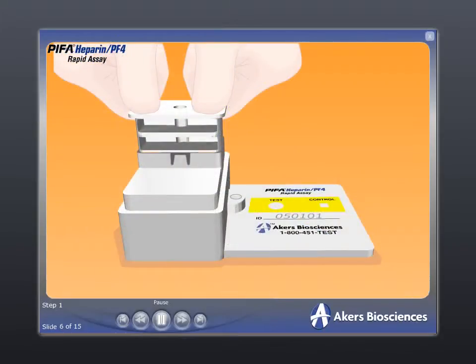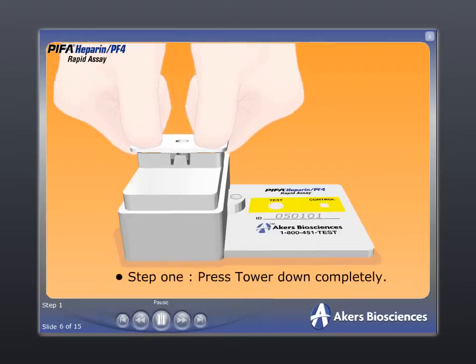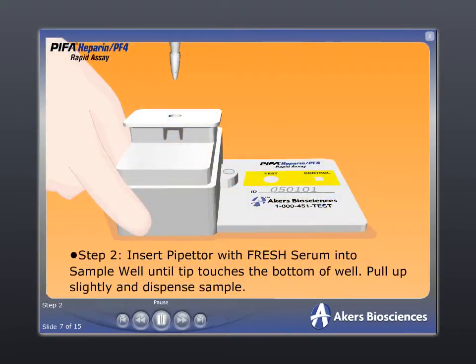The test procedure is quick and easy and consists of five straightforward steps. Step 1: push the tower down completely to release the reagents into the reaction chamber. Step 2: insert the pipetter with the specimen of the patient's fresh serum into the sample well in the tower until the pipetter tip makes contact with the bottom of the well. Pull up slightly and dispense the sample.